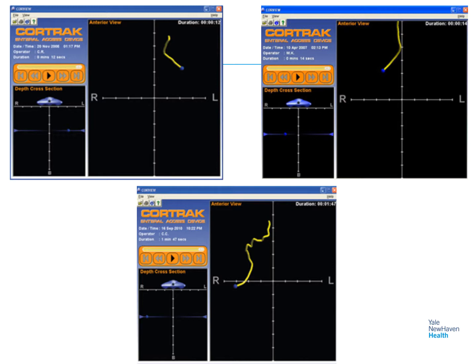These are all Cortrak images taken from our hospital, and these are patients where the tube was inserted, and instead of having that vertical drop that brings the tracing all the way down to the X and Y axis, this tube either bifurcates to the right or to the left, and unfortunately that's a signal that you are in the lung. Now, when you pick that up early, usually somewhere between 30 and 40 centimeters, you're able to stop progressing the tube, pull back, and start the procedure again or reevaluate if this is going to be a safe patient to place the tube on.